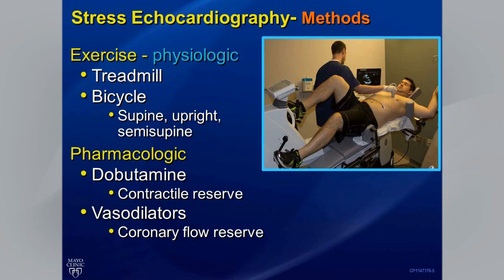Now there are these various methods that can be combined with echocardiography to do a stress test. Exercise is indeed the most physiologic form of stress testing, and therefore in patients who are able to exercise, it is the test of choice.